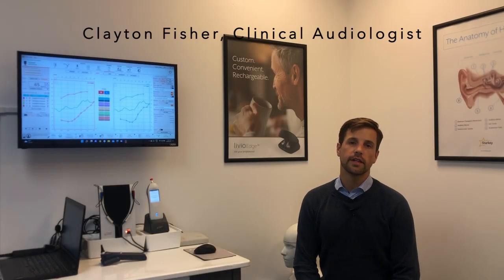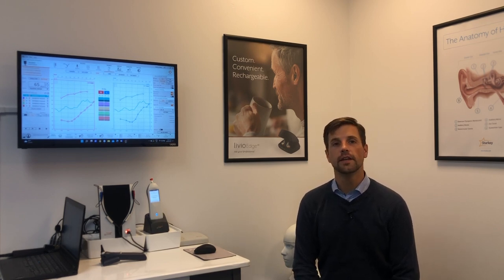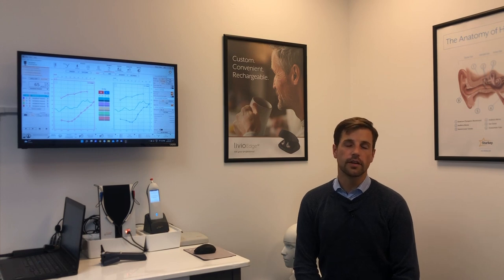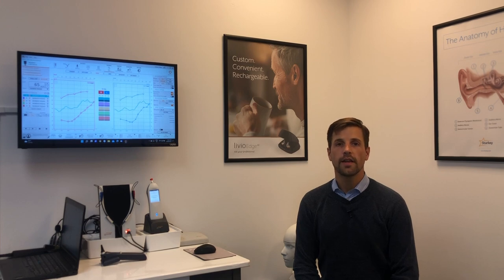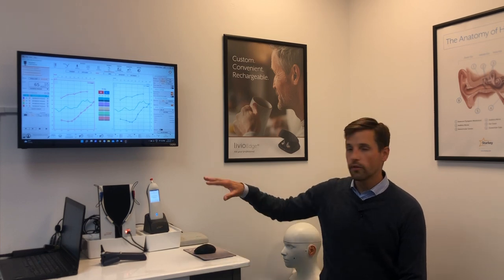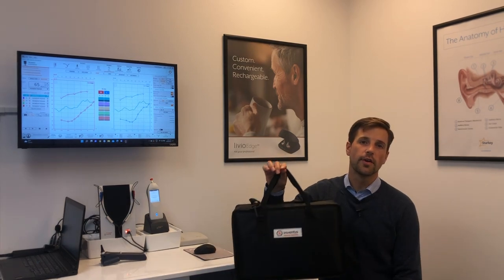Hey everybody, I'm really excited today because I have started my own hearing aid clinic and for the first time I'm able to provide audiology services independently. In doing so I had to get all my own gear, and today I'm just going to share with you the gear that I purchased and why, and how I can fit this entire setup into a single bag to take with me on the road.